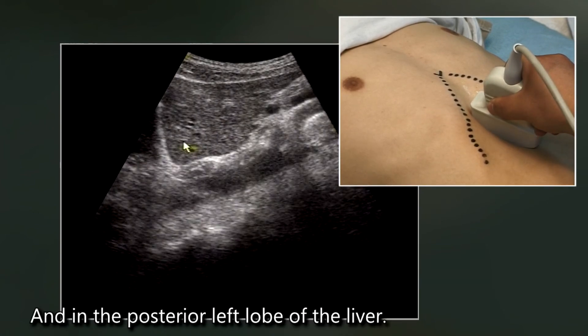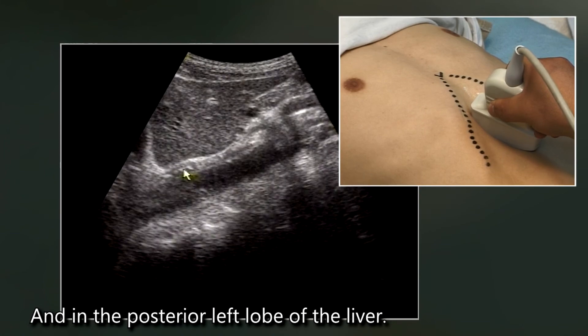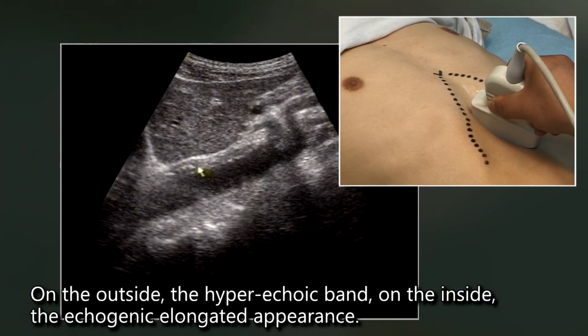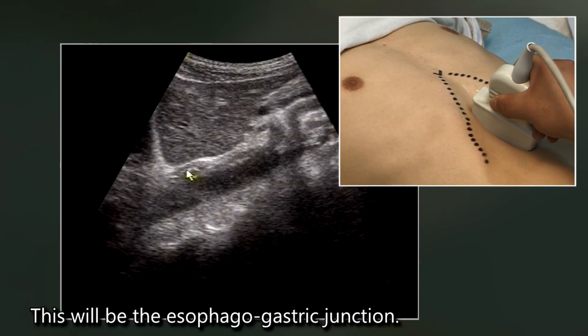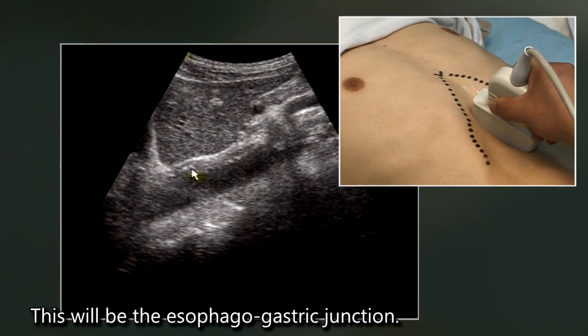Anterior to the abdominal aorta and posterior to the left lobe of the liver, on the outside there is a hyperechoic band, and on the inside an echogenic elongated appearance. This is the esophago-gastric junction.